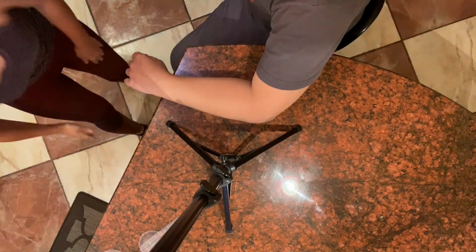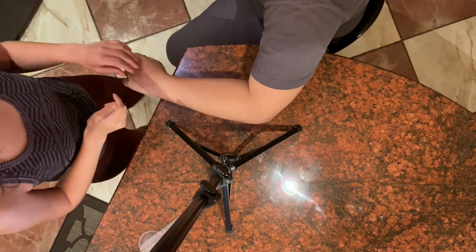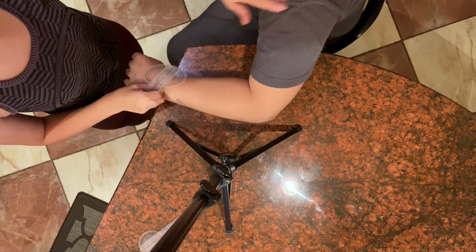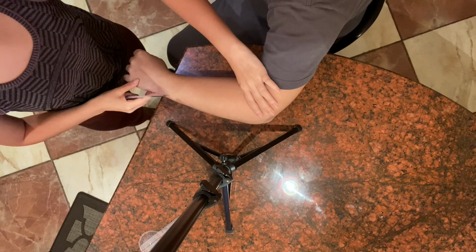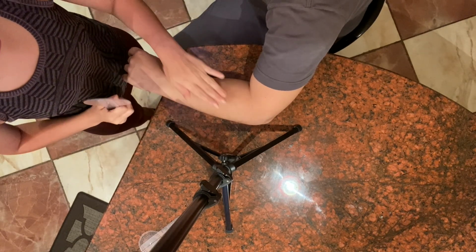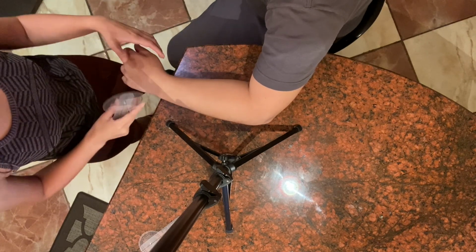So next off, we're going to be doing wrist radial deviation. So we're going to position the subject so that he's seated and his shoulder is abducted 80 to 90 degrees. His elbow is flexed 90 degrees, and his forearm is stabilized on a supported surface so that it can't pronate or supinate during the measurement.